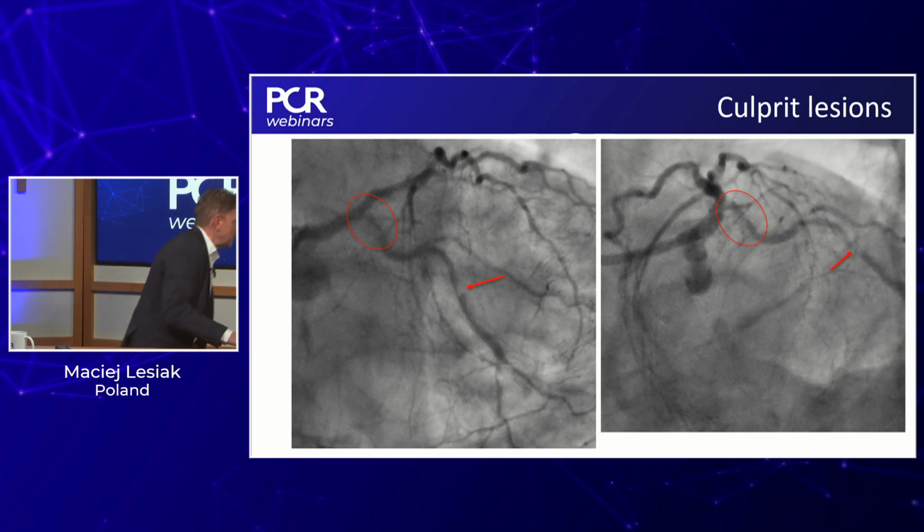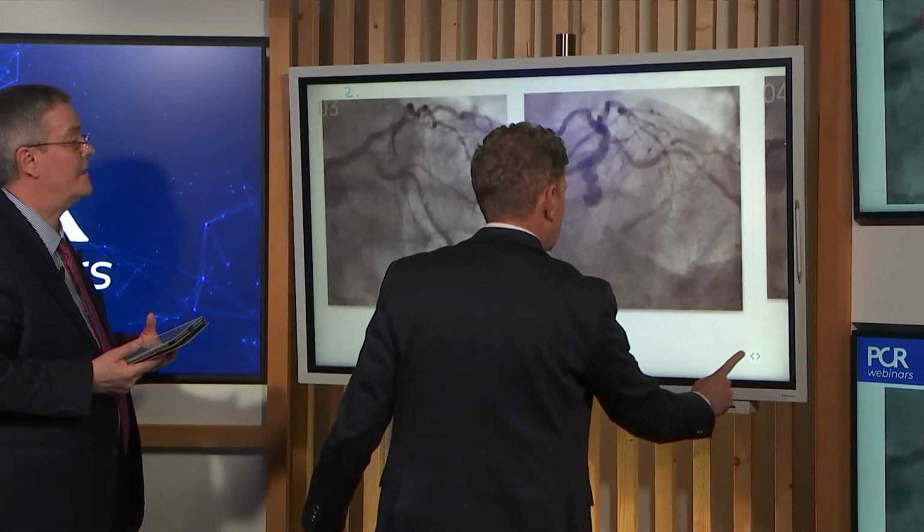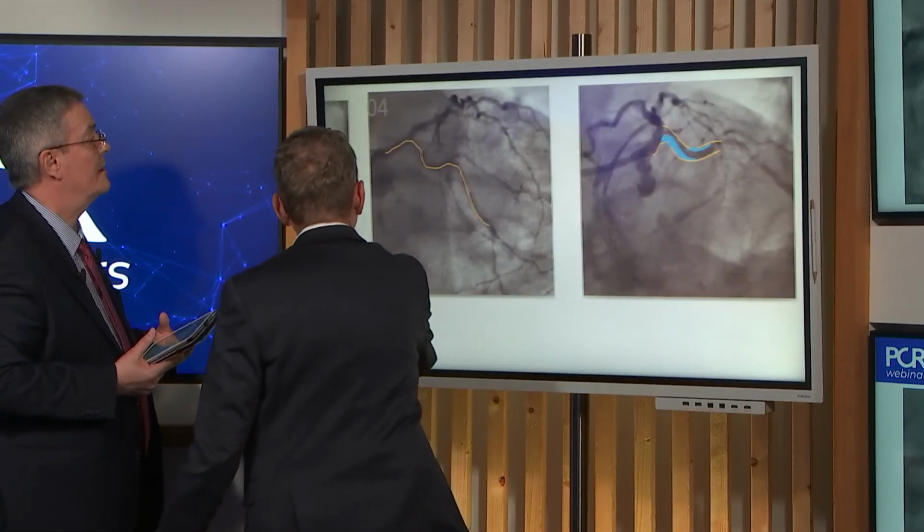Join at the smart board, so we have already prepared. Yes. You need to take the arrow. Yeah, okay. One more. And just stay aside so we can see.